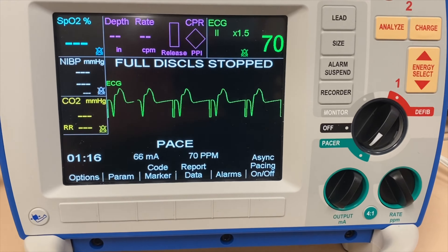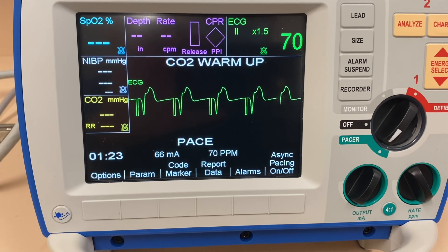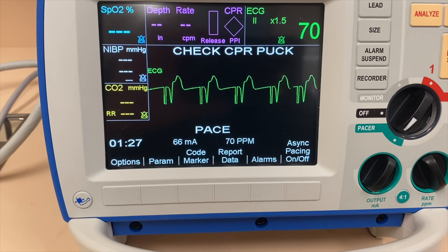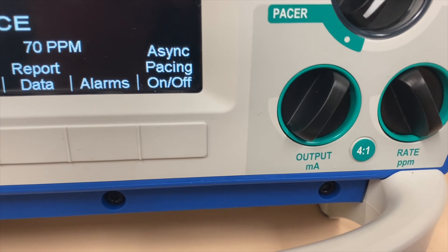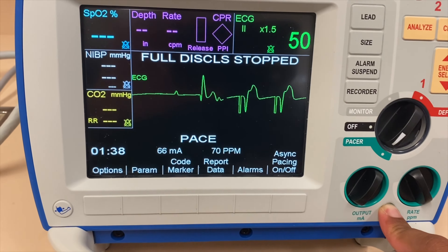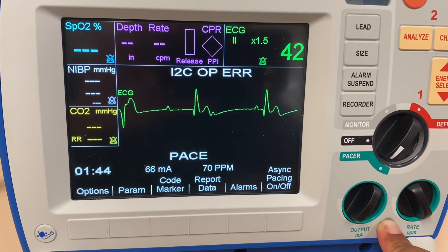Once you see the capture, we are now pacing our patient. One of the key features of this machine is your see-through CPR. When you are pacing, you'll be able to see through what is the underlying rhythm. When you press this 4-to-1 button here and press and hold, it will reveal what is the underlying rhythm of your patient, which is a nice feature.